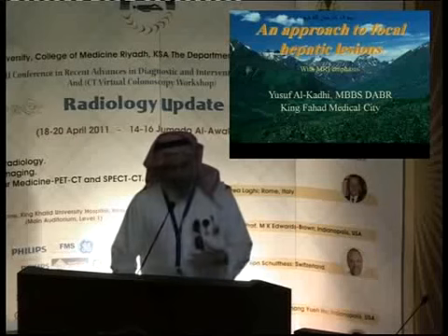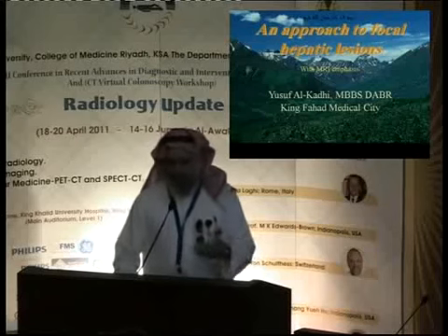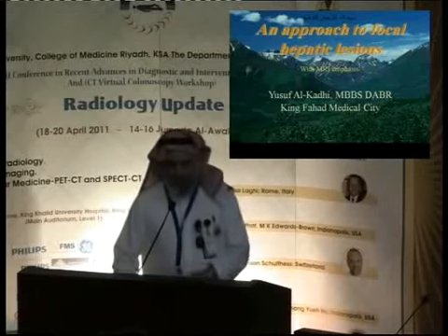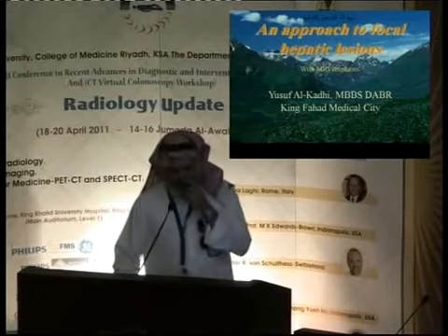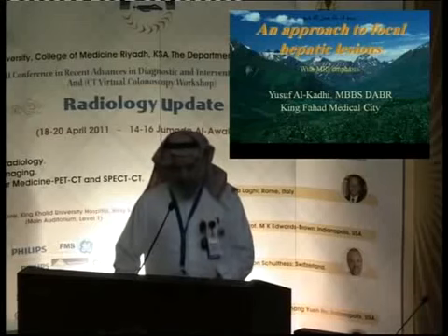modality. It's a wide topic, obviously, and it's very difficult to go over all types of focal hepatic lesions within a short presentation. But I'll try and give some ideas and maybe some pointers about the sort of things that might help in this process.